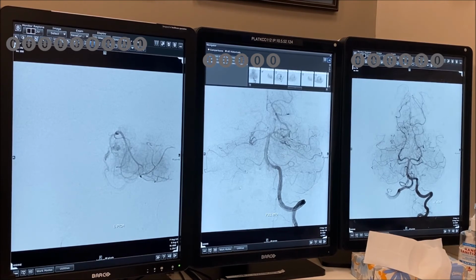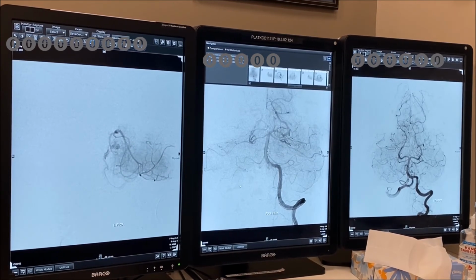Remember what I said: when you don't know what you're dealing with, you go from distal backwards? Okay. So distally I have this Y. You see this Y here? You see the Y? Yes. This picture by itself tells me there will be no problem sacrificing this artery.